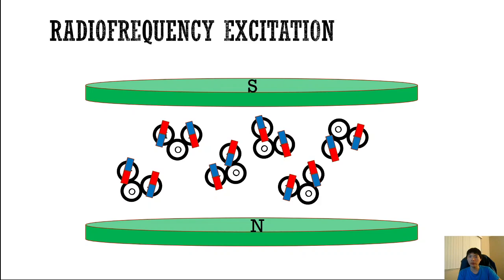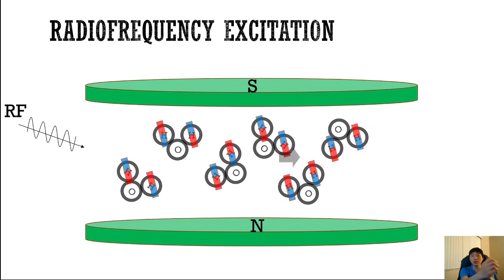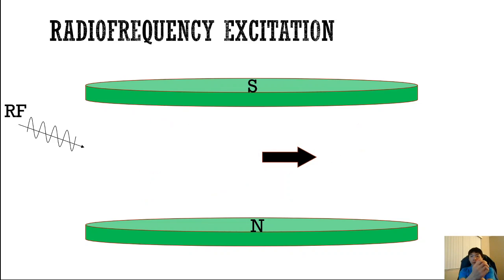So you can receive the magnetic response when you excite our hydrogen nuclei. So let's see what happens. When you apply this radio frequency excitation, you're kind of driving everything in phase, and so now when the spins are rotating, they're actually rotating in phase, and they add up together. So this is what is known as coherence. That is producing a net magnetization.